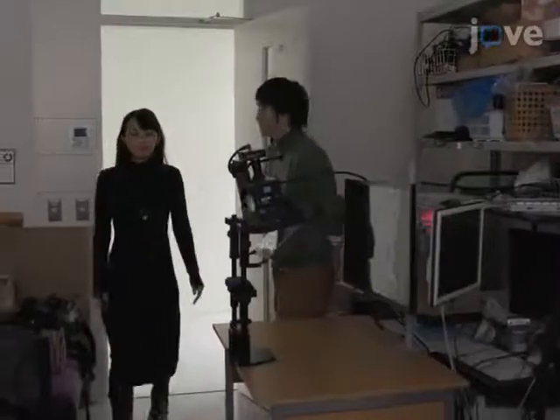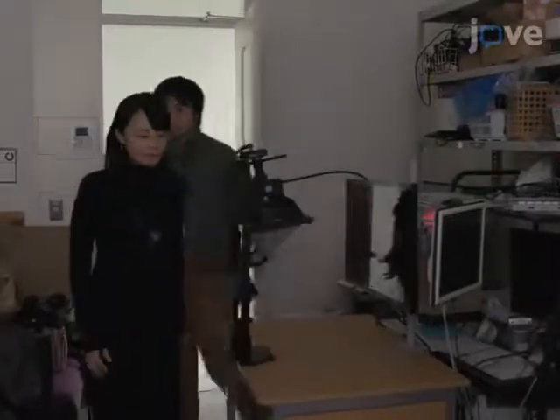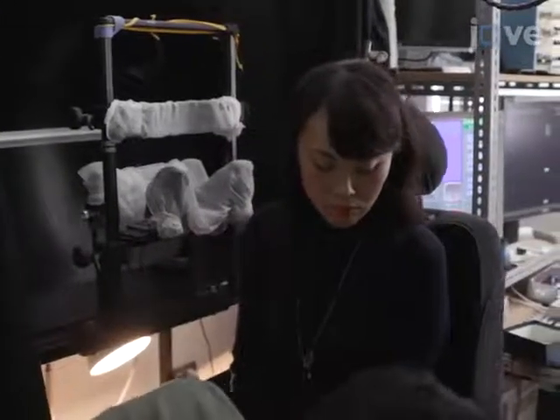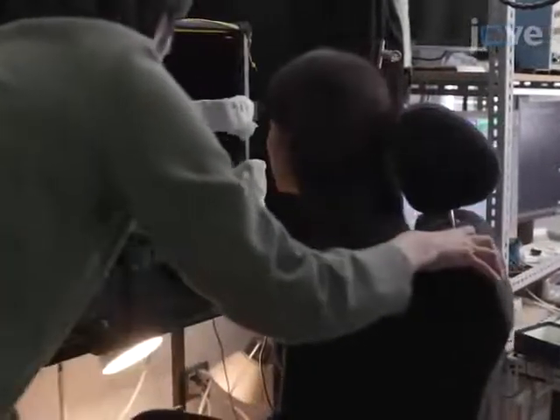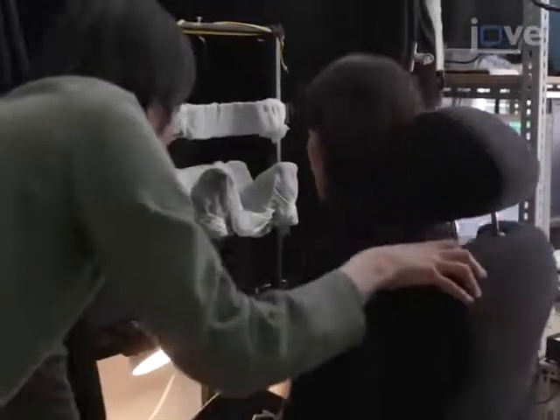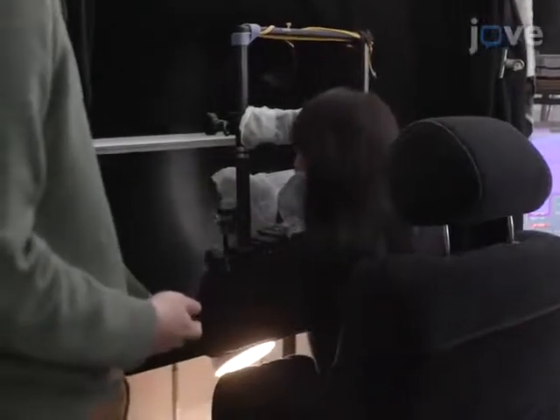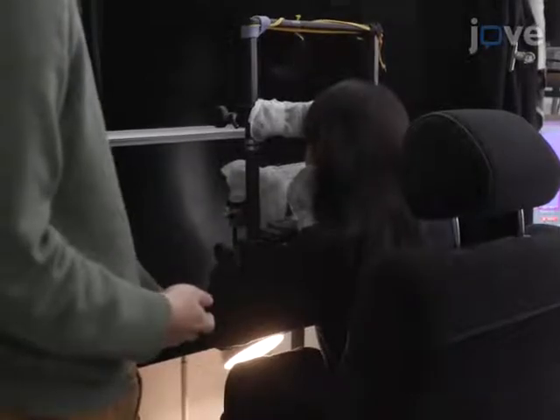Begin by escorting the subject into a room with low ambient illumination. Have the subject sit in front of a black, concave dome-shaped screen measuring 90 cm in diameter that contains light-emitting diodes, LEDs, embedded in pinholes, which serve as the fixation points and saccade targets used for the oculomotor paradigms.